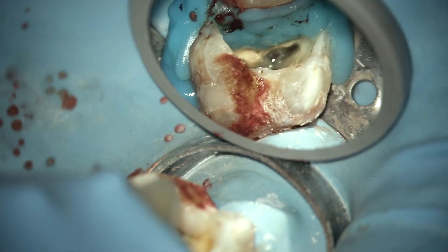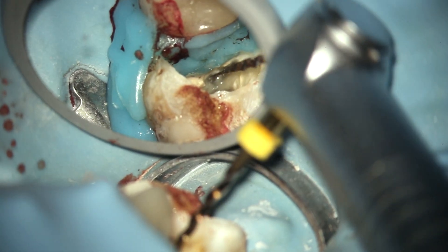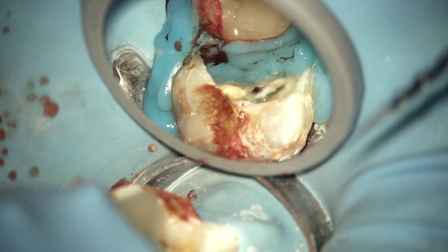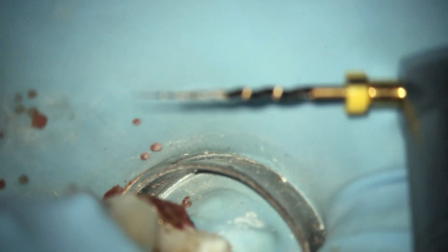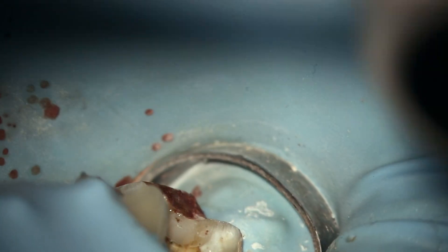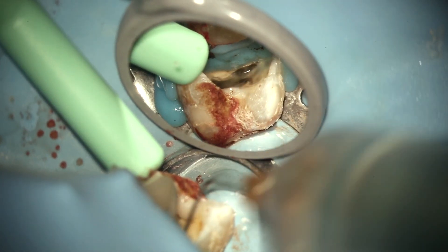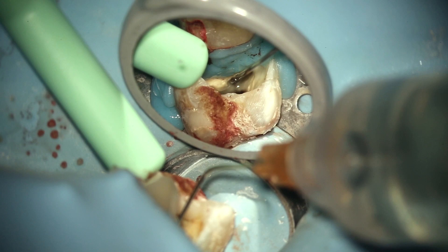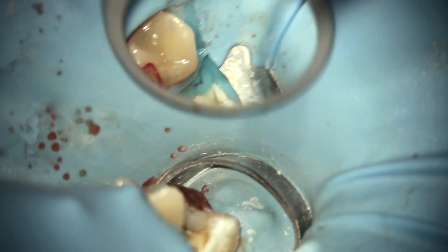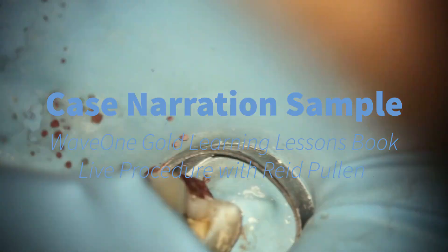All four canals now have a coronal flare. For the MB2 I often do two passes — two coronal flares with the ProTaper Gold SX — because the MB2 is a very delicate canal and you have to be really gentle with it. The last thing you want is to break the tip of the SX in the canal at the onset. It's been a long time since I've done that because I follow the RCT playbook: get a nice loose 10c in there, then the SX slides down that same distance and safely opens the coronal third.